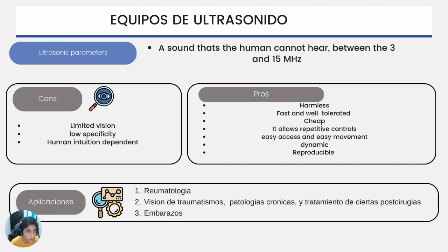We have pros and cons. The pros are that it is harmless, so it doesn't cause damage. It's fast and well tolerated. It's cheap. It allows repetitive controls, easy access, easy movement. It's dynamic because we see the image in real time, and it's reproducible.